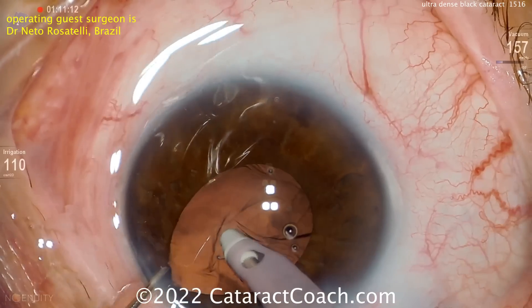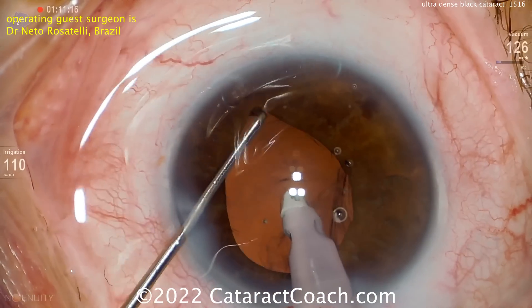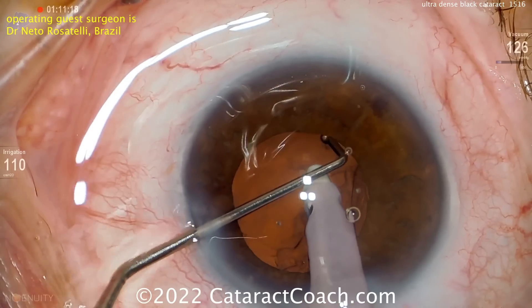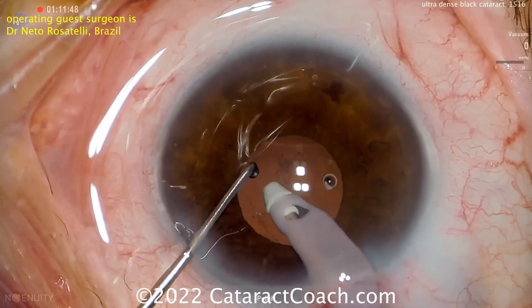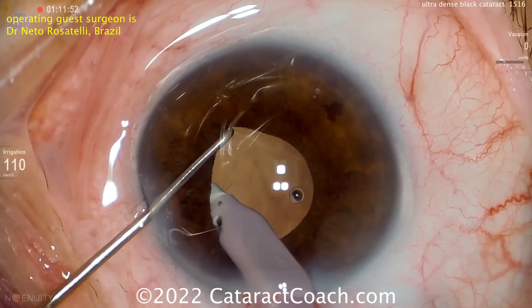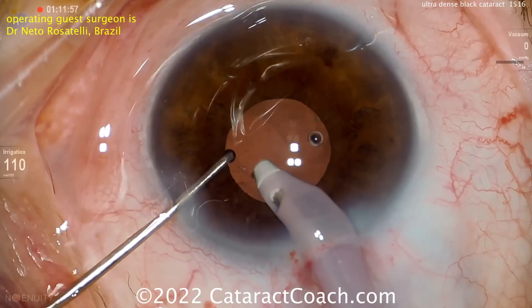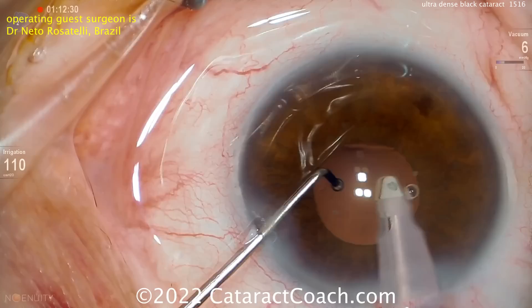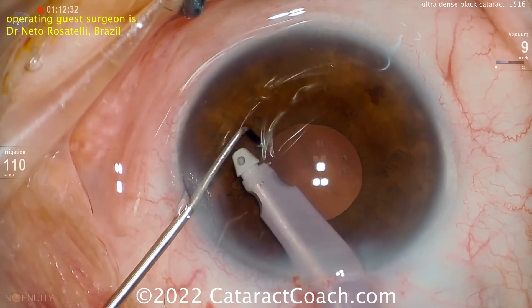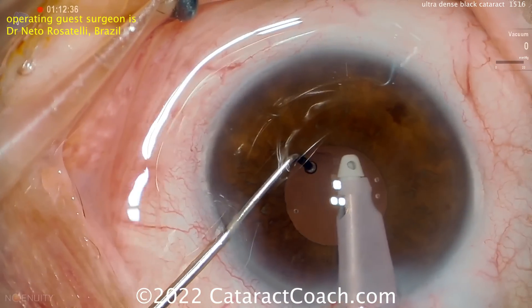Can you imagine how incredibly happy this patient is going to be? Pre-op acuity was probably hand motion, maybe even light perception. This patient is finally going to get some light on that retina — that macula is going to be so happy to finally be receiving light signals again. So nice cleanup here at the end — looks beautiful. Probably time to put the lens in; I'm guessing a single-piece acrylic lens.